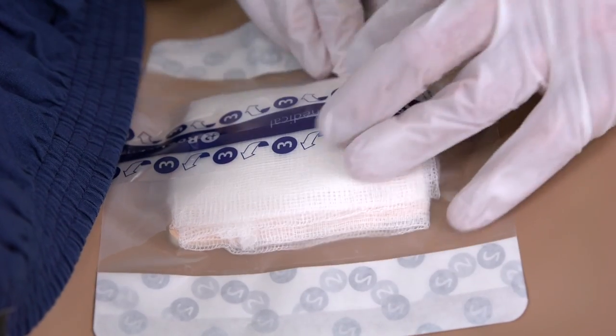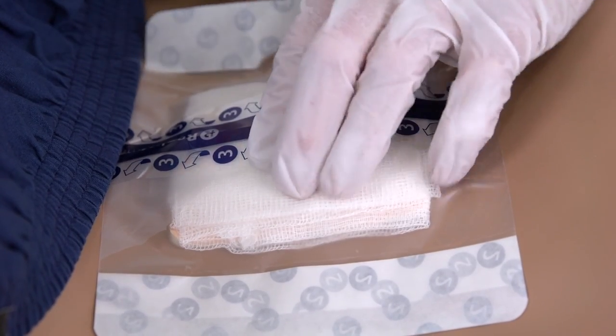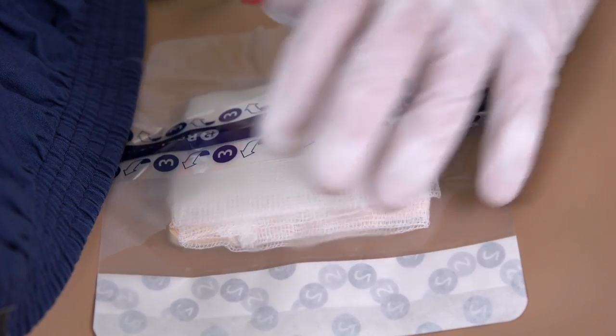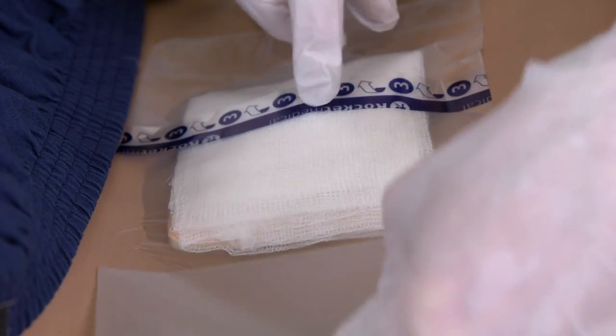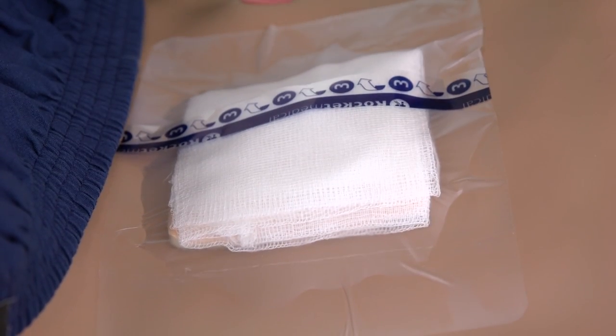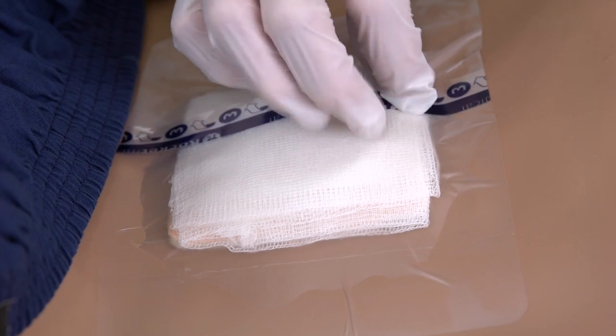Remove both end paper tabs labeled 2 while continuing to smooth the edges. Then, remove the cover sheets labeled 3. Smooth and press the edges of the dressing, making sure that it's completely secure.